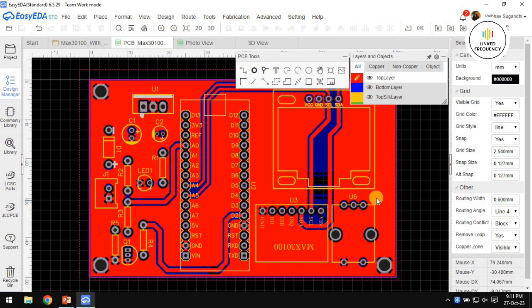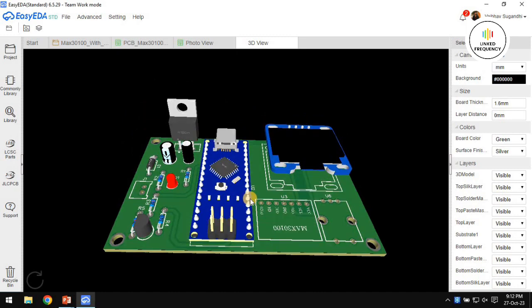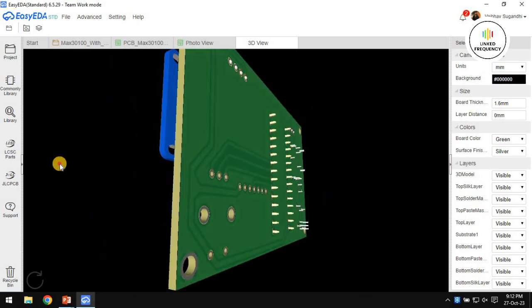All right, now you can see that the entire PCB project is ready. Again, this one is a project because it is an integration of multiple modules, hence I call it a project. You can see that all these modules are placed in such a way that it looks like a project for a mini project, or whatever kind of project you want to call it. I call it a practice project for PCB designers, but for your college purpose or for your hobby project, call it whatever you want.